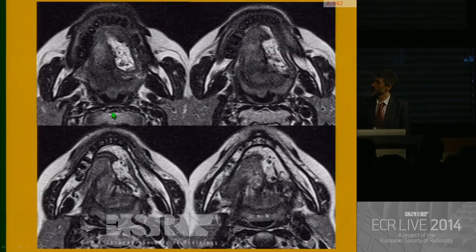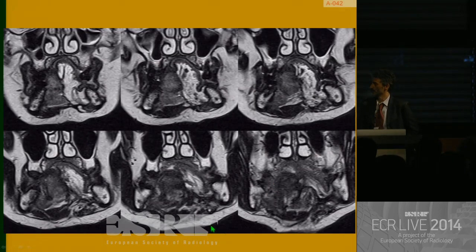So the patient comes for MR, and you see there are a lot of things going on because surgery has been performed. This hyperintense area corresponds to a flap that was set to rebuild the floor of the mouth. Where the activation was found on PET, there is this area of intermediate signal, which may be misleading on axial plane, but becomes clearer if you move to the coronal plane, because this is what you were looking at on axial plane.